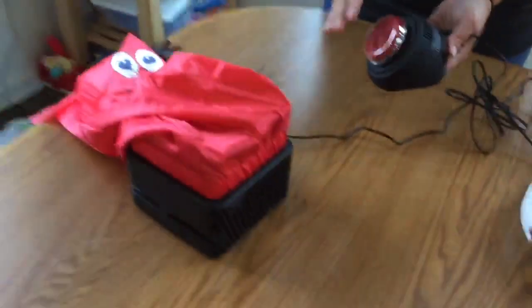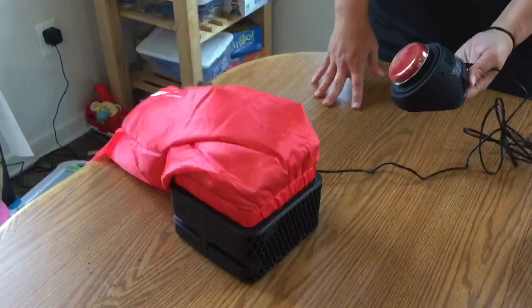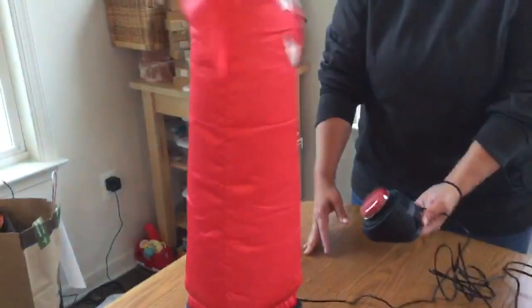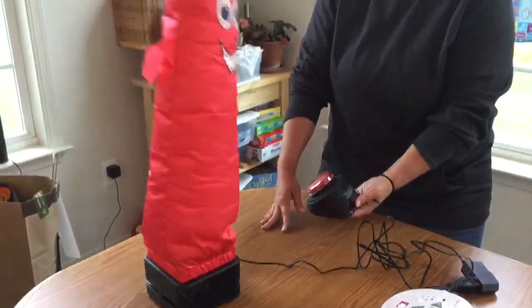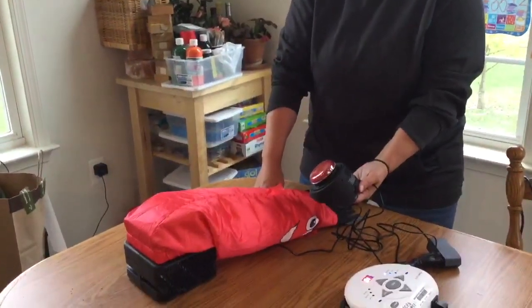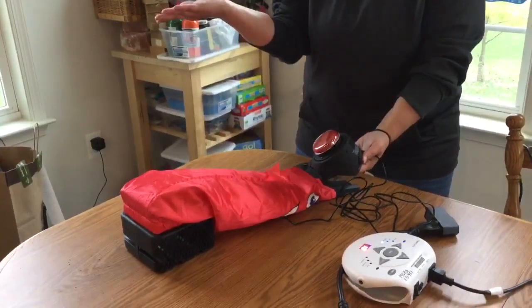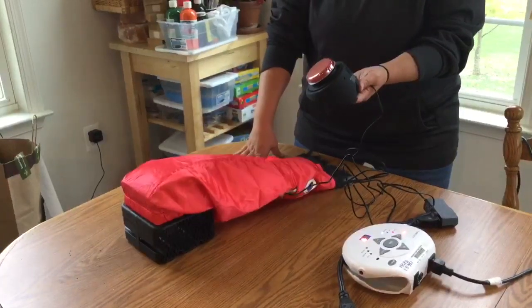Here we go. I hit the switch. Whoa! Look at that wacky inflatable tube man. The 10 seconds is up. The toy stops. If the child wants to play with their toy more, they just have to hit the switch again.